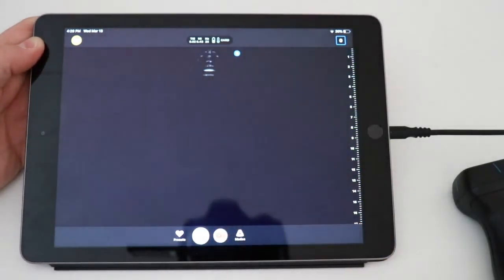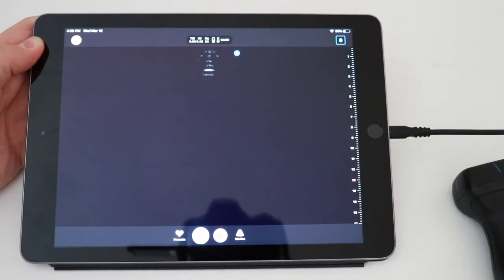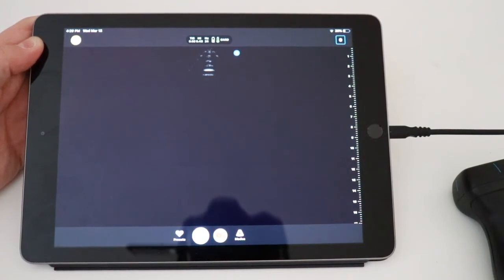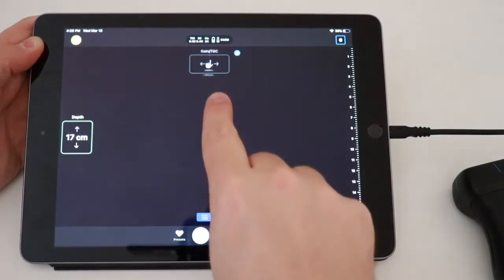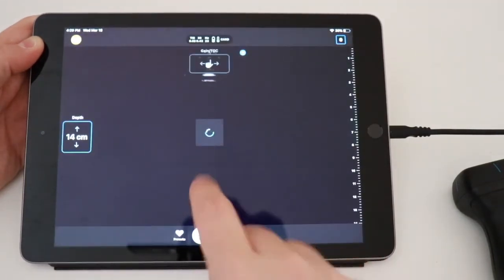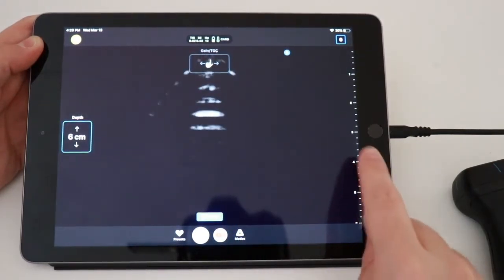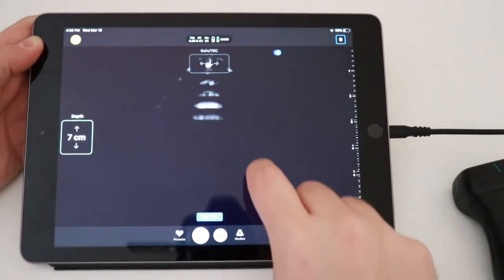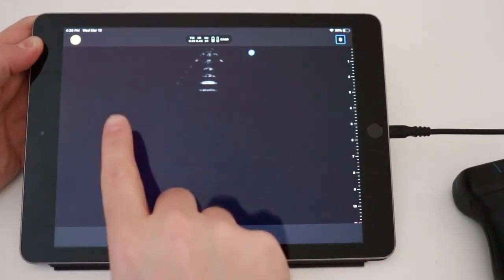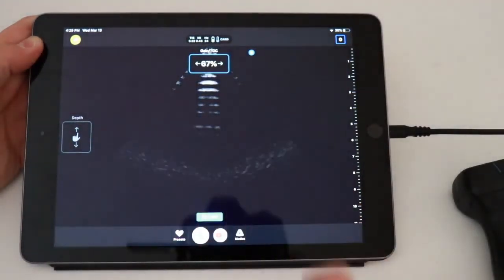Now, if you want to change the depth, note that the depth is all over here on the right side. That's the opposite side of the screen as compared with the Lumify. And there are no knobs here like we had on the Lumify. Instead, all we're going to do is drag this down and drag this up to change the depth. Again, it auto freezes if you're not doing anything in a while. So we can drag all the way down to very shallow depth, and we can drag up. And if you want to change the gain, all you have to do is go to the right to increase the gain, the left to decrease the gain.